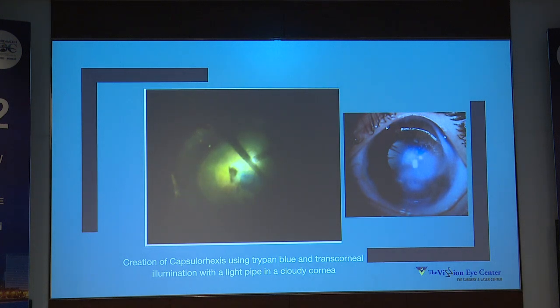Yes, sir. I think you have very usefully done the case. Pre-operatively, one thing is a proper retinal photograph of the patient to be done pre-operatively. Even subtle ERMs can be detected and it should be noticed. Every patient that I do, I have an AS OCT, a posterior segment OCT, and a fundus photograph, and I'll tell you one more step that I do, sir.